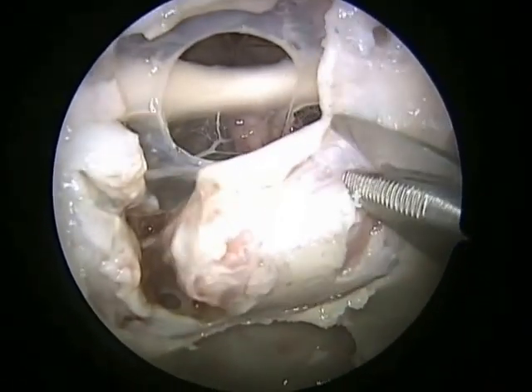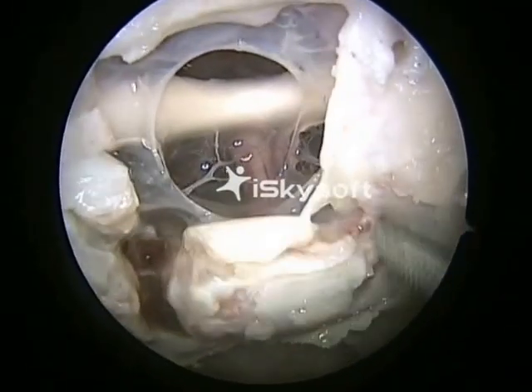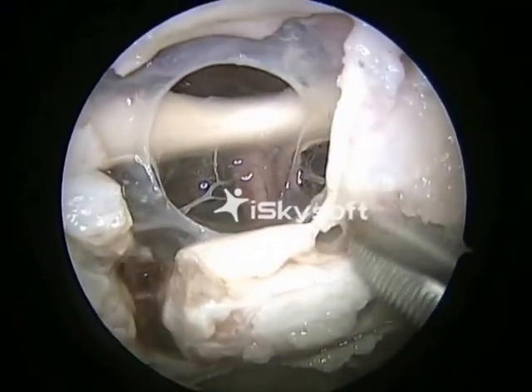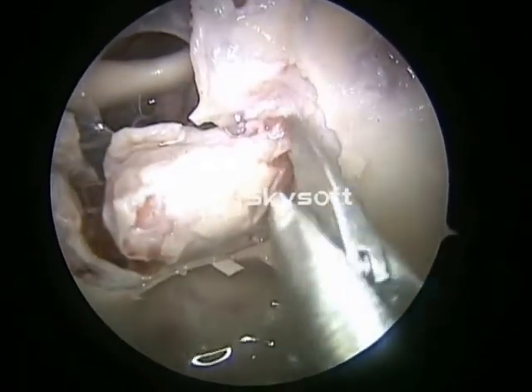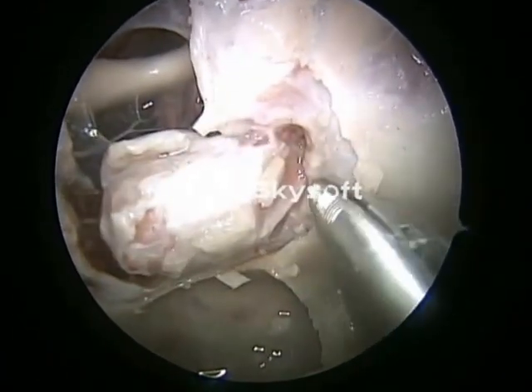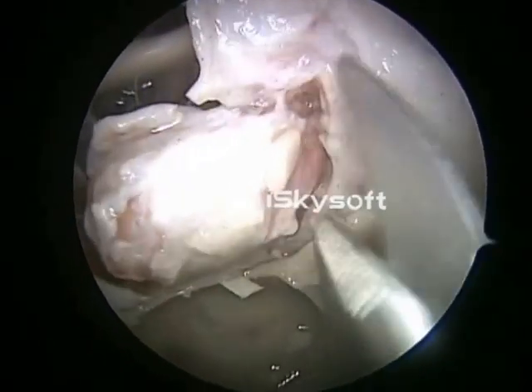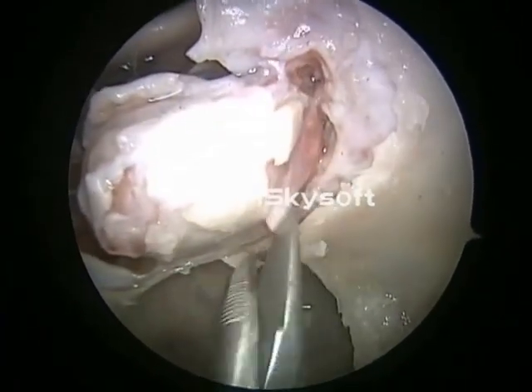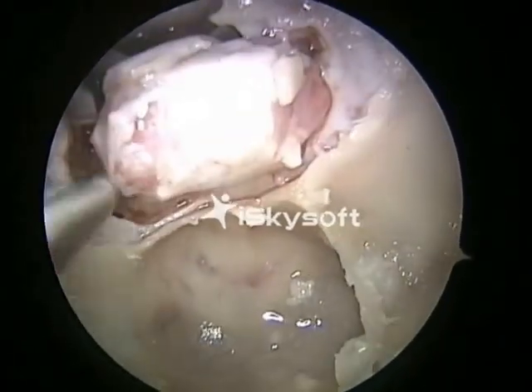That is the superior intercavernous sinus on the left side. In a live situation, we would like to diathermize it before cutting it. And now the pituitary is being lifted off the dorsum sellae.